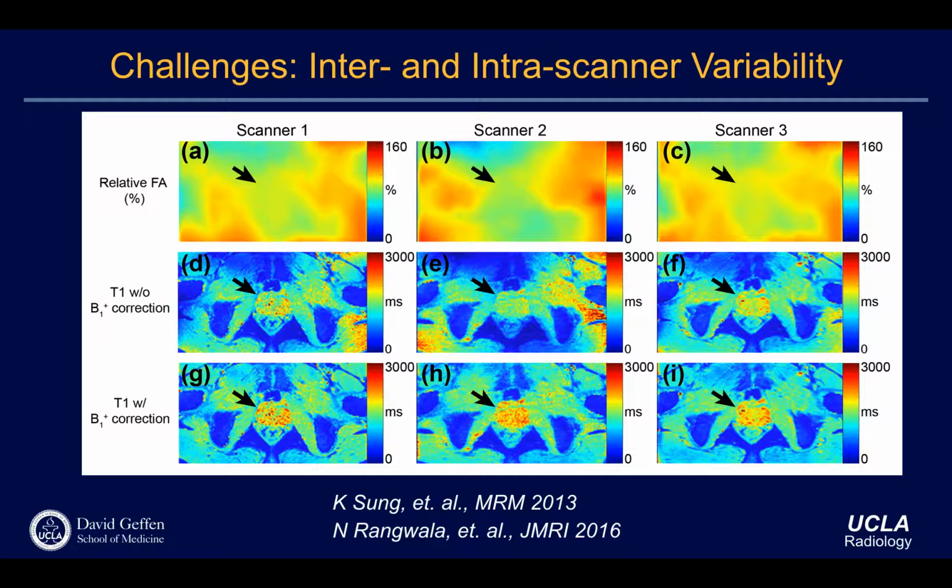Is it different from the B1 sensitivity map that is usually provided? Right, that's called the B1 minus field. That's different. B1 minus is more so-called intensity variation. B1 plus is more intensity and contrast variation because it actually changes the flip angle, whereas B1 minus is just changing the overall signal intensity. So B1 minus, sometimes you can say it's easier to compensate if you know the pattern. But here, B1 plus is not easy to compensate, even though you know the pattern. So for every scan, you have to get B1. Yeah, that's the bottom line.